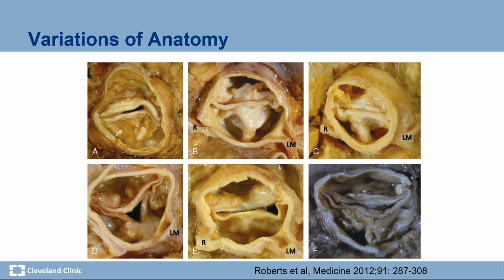So when we look at the literature on bicuspid aortic valve TAVRs, you have to pay attention to what kind of bicuspid valve people treated, because, as you see in the bottom right, a small fused bicuspid raphe is different from a bicuspid with a very calcified raphe like on the right side.